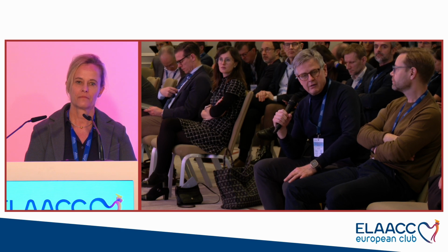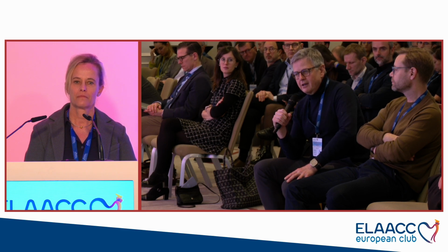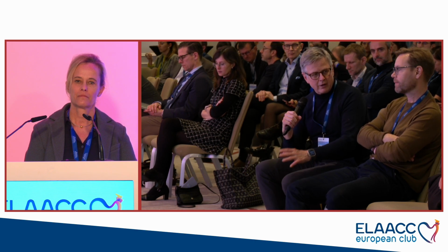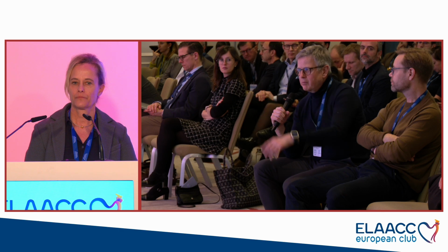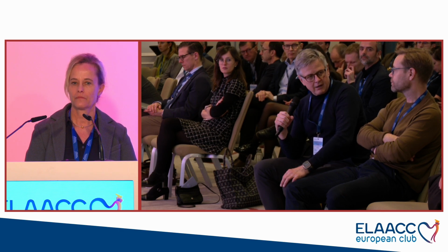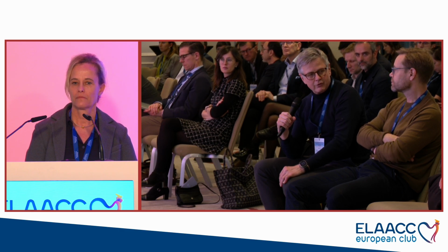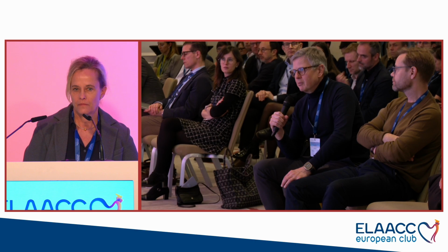I really enjoyed this presentation, and it has not been our attempt from the beginning to have a classification where CT was the reference. I think Nina excellently demonstrated that all the morphological criteria can be recognized on TEE, and we could have had this in the first edition of this paper, but in some way we cannot have it all. But this is a very logical outcome of this meeting, that we will have a follow-up publication where Nina can demonstrate all those examples. They are extremely nice in a paper, so that this classification can also be applied to centers that are only using TEE. I think it will be extremely important to show that.